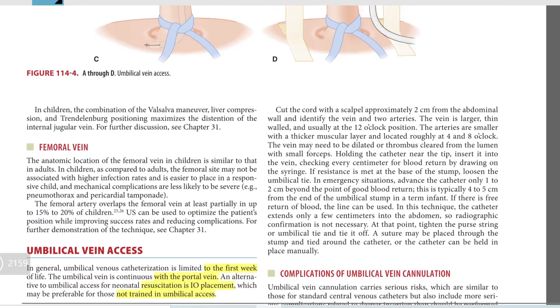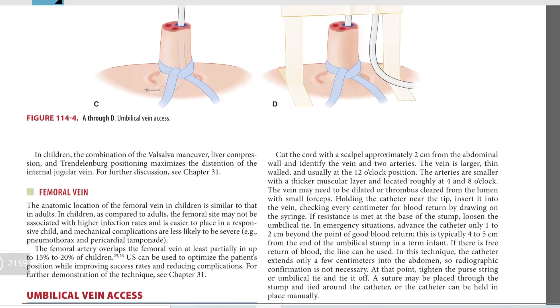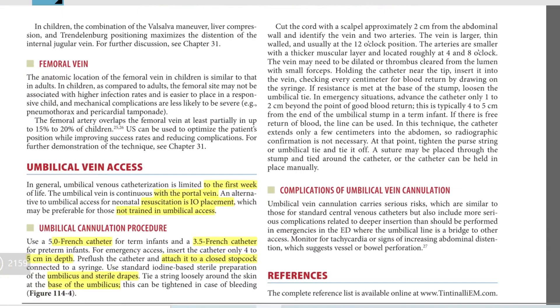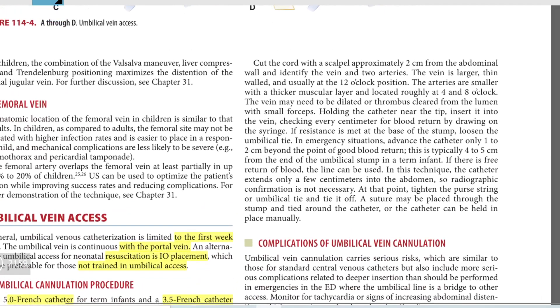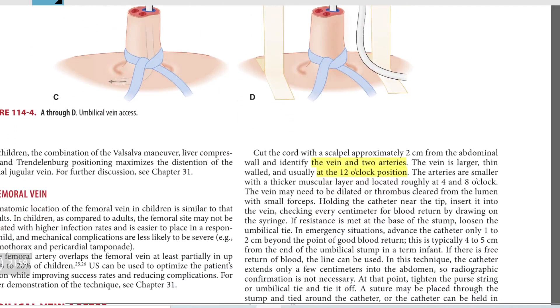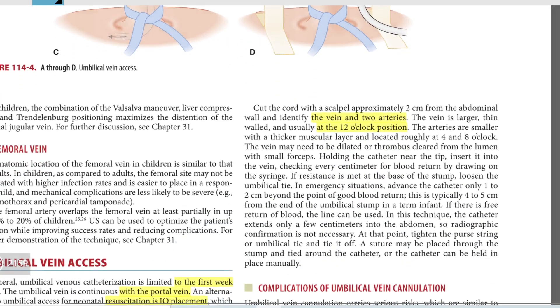Cut the cord with a scalpel approximately two centimeters from the abdominal wall. Identify the vein and arteries — there are two arteries. The vein is larger, thin-walled, and usually at the 12 o'clock position. The arteries are smaller with a thicker muscular layer and located roughly at the four and eight o'clock positions.